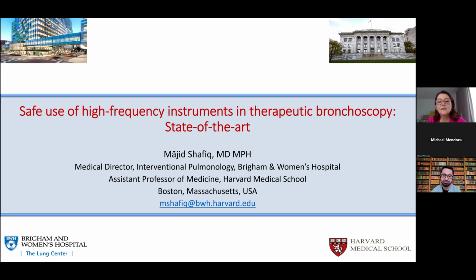another question from the audience: which will you prefer, rigid Fogarty cryo versus use of laryngeal mask, flexible and Fogarty and cryobiopsy in terms of time saving and safety? Yeah, do you use laryngeal mask or do you usually use rigid bronchoscopy for cryo? Between those two, I would absolutely use the rigid whenever possible. I think it would be both time saving and safer. I guess there's not much time to be saved, but it doesn't take you much of any time to get to the rigid. In fact, you take away one step of the anesthesiologist placing the airway for you and then handing the case over to you. Rather, as soon as the patient is induced, you go right ahead, you get your rigid in, and you're good to go. So I think you're actually saving time that way.